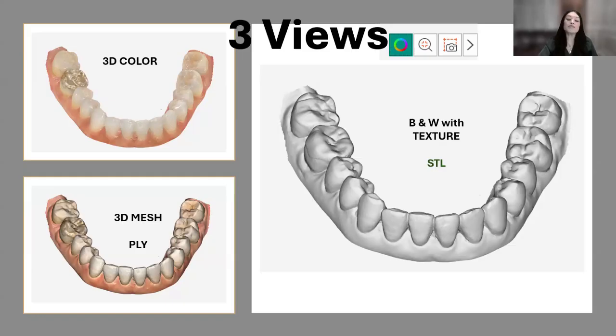We have what's called a 3D mesh view, which is, I consider, a cartoon image of the scan. We also have another way of describing it, and this is what we normally use today, is we call it a PLY file. That is a 3D mesh, cartoon looking.